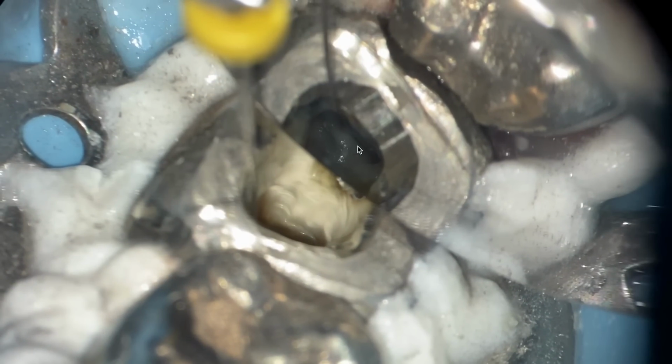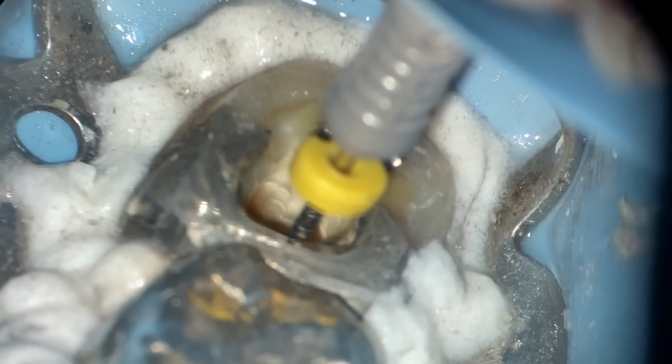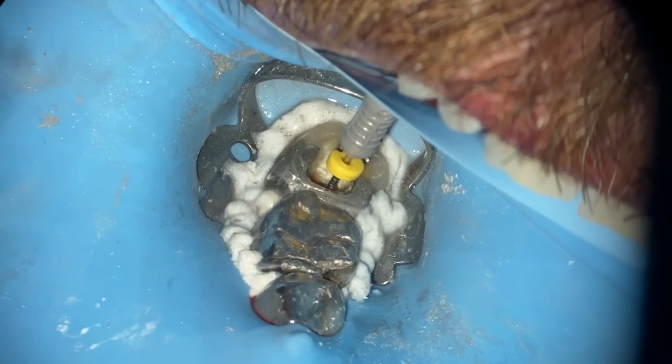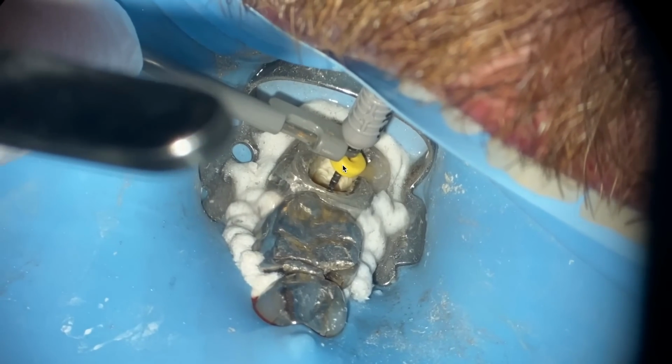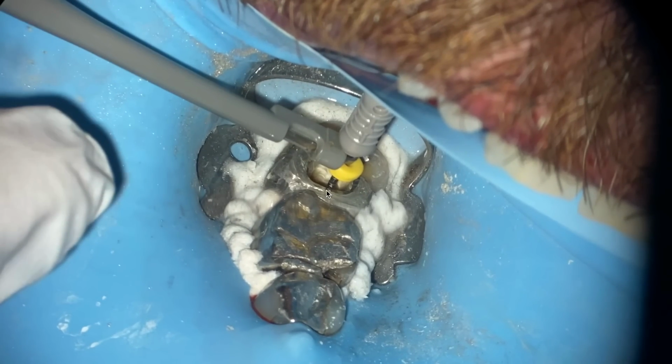Now, when I was beginning dentistry, I got confused because the statement was always, oh, you always need to have some sort of irrigant in the canal to make sure your apex locator works. Well, that doesn't mean in your pulp chamber. It means literally in the canal, and it could be at the apical portion. So what happens is, especially with these amalgams, now you see what I did right there, the apex locator is ringing like crazy.